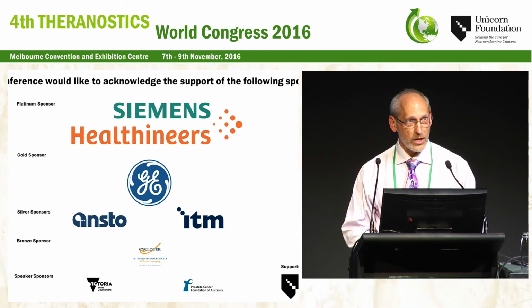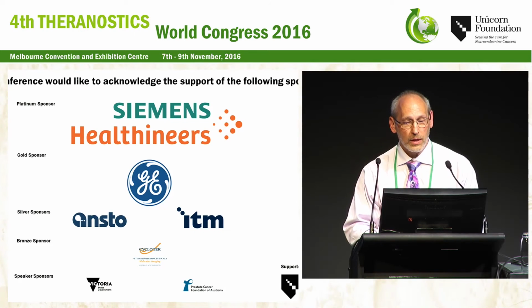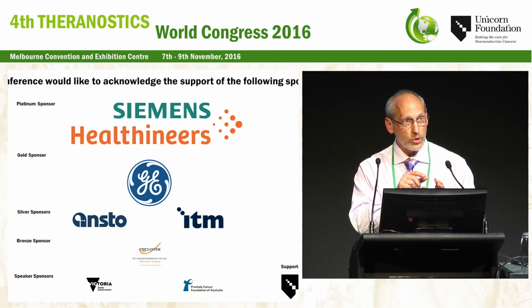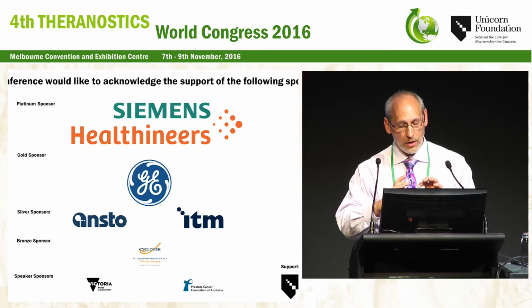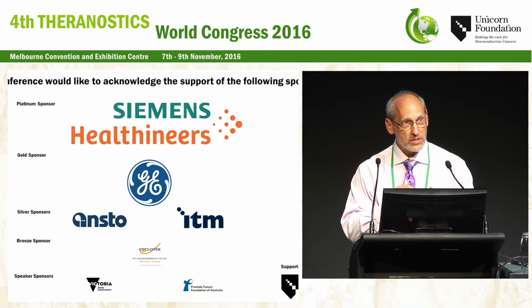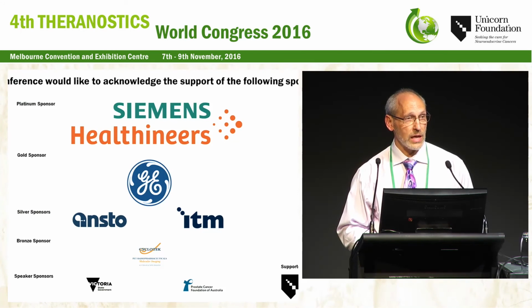You don't want to measure the stuff that's in the collecting system. When one does the expansion of that volume of interest of the kidney, first the kidney, we avoid the collection system, the kidney volume itself, number one. Then we expand that by 1 centimeter, but then in particular, if we see there is activity in the collection system, then we modify that volume of interest to avoid where the urine happens to be, because that does impact it quite substantially.